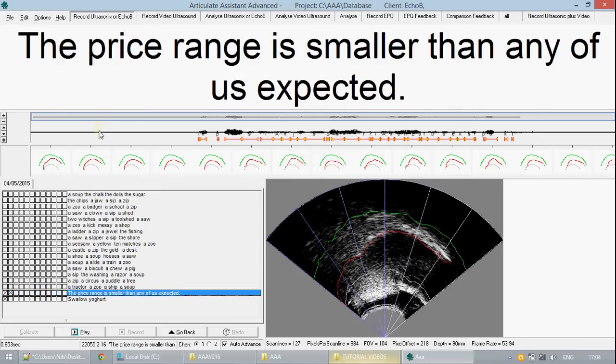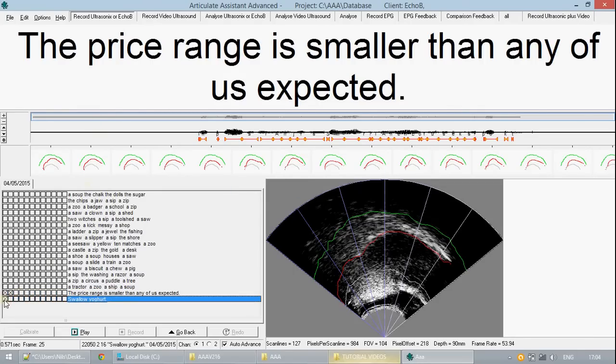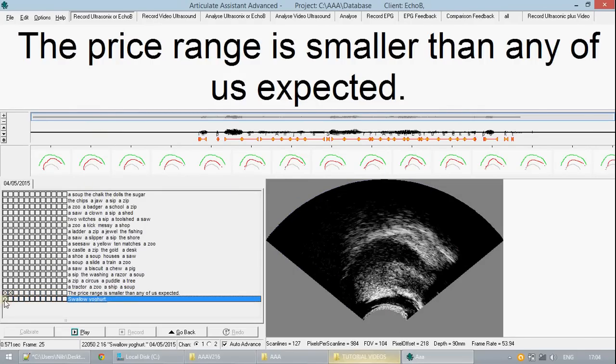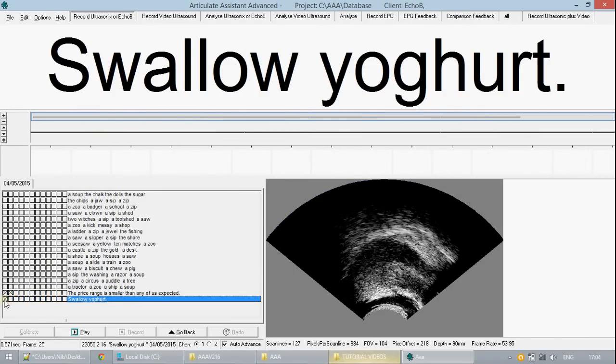So if we move over to the other data here we can try putting our own splines on. This data file is for the swallowing of some yogurt.